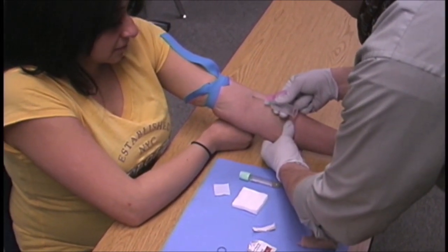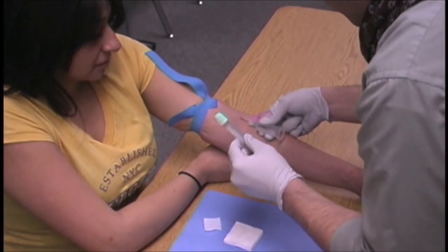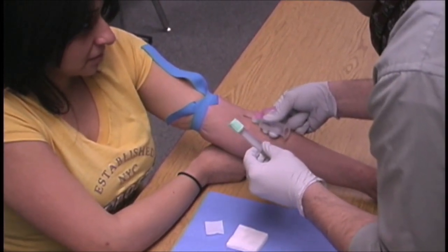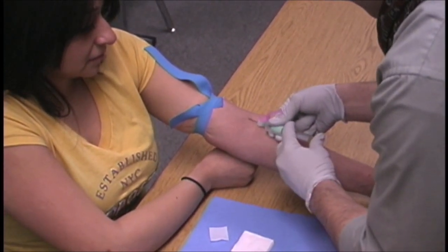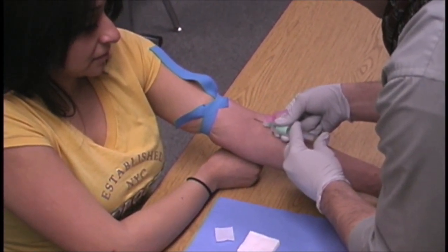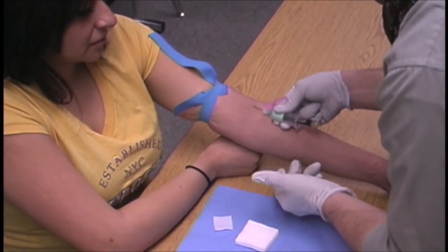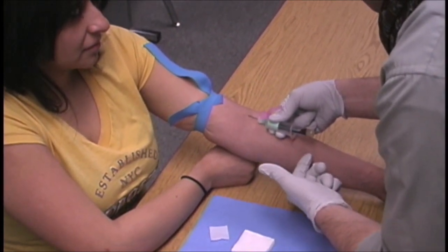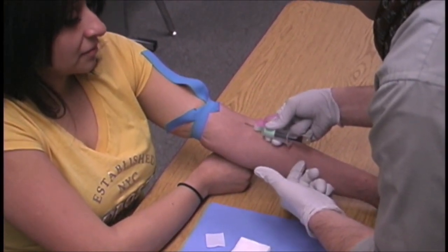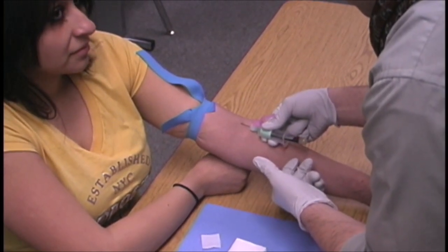He inserts the needle into the vein at a 15 to 30 degree angle. Once the bevel has gone in, he stops. He picks up his tube label-down and inserts it into the vacutainer holder using his middle and index fingers on the flanges with his thumb at the back of the tube. You can notice the blood now flowing into the tube. Do not remove the tube until all the blood has flowed in and the tube has stopped accessing blood.